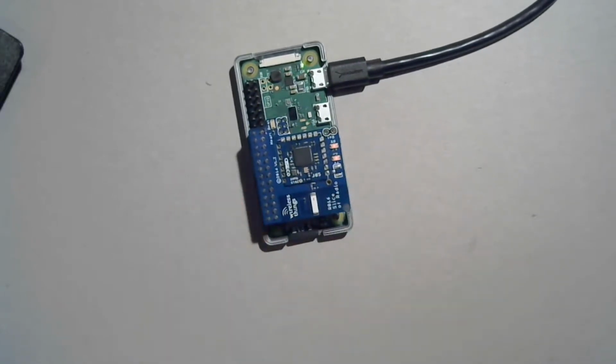And so under the covers, the UART is essentially its own gen server. It handles the management of the state of that serial port and all the communication that goes across it. And then there's a couple of small layers in between, but at a higher level, there's a pump gen server. And that pump gen server has the responsibility of doing logical communication with the pump. So underneath the covers, there's like packet radio and all kinds of other stuff going on.